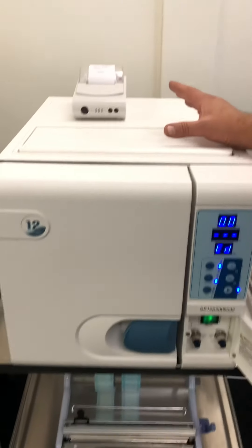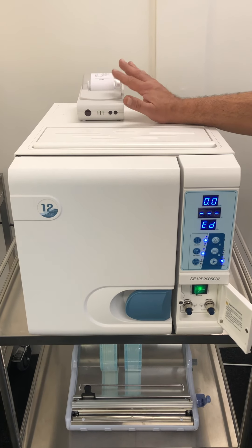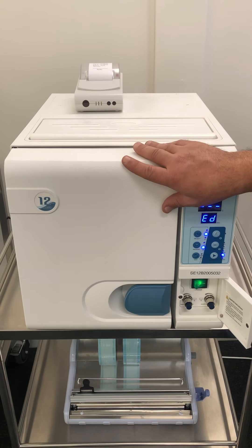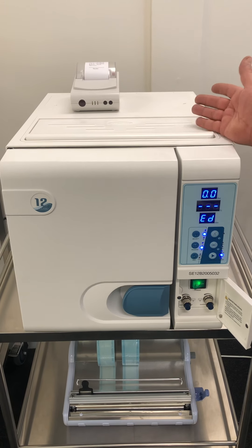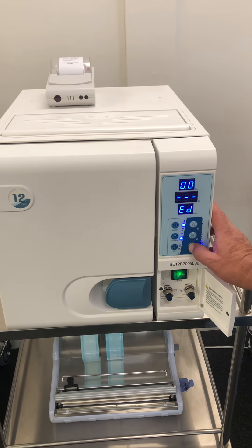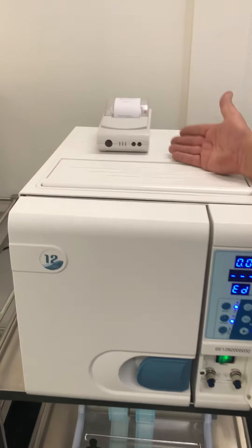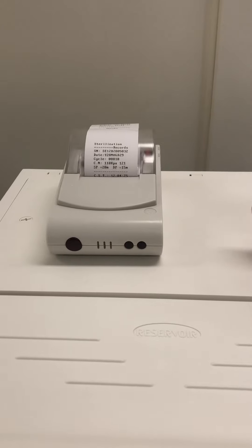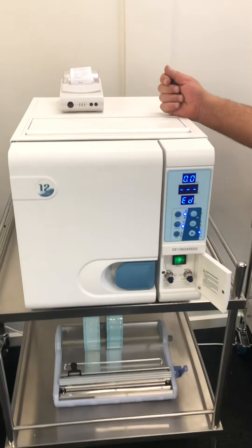Going back to what I was saying: you finish your cycle and it hasn't printed, or you've run out of paper. Once you have fixed the printer problem, and providing you do not open the door, you can reprint your last cycle. To do that is very simple — keep your finger depressed on the start/stop button and it will print your last cycle. Do not open the door, otherwise you've lost that cycle and will have to re-sterilise your goods to keep your records.